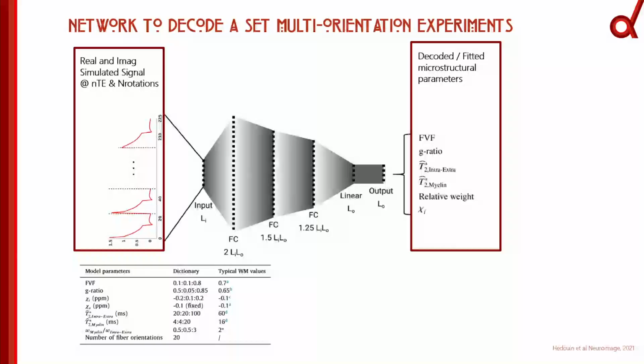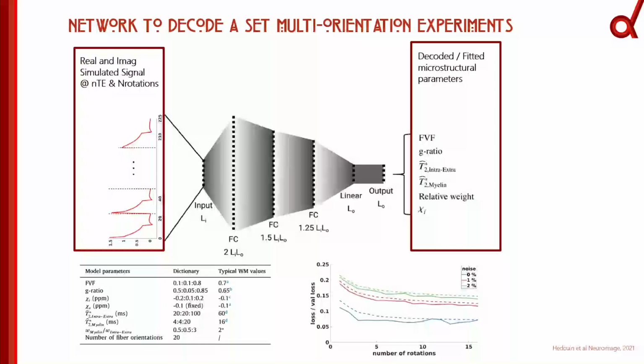And actually, we're doing a lot less demanding things than we do with myelin water imaging. This is a sanity check to see if our models are converging and how many rotations of the brain we need to get robust G ratio maps. The answer is that you need at least 3 large rotations.